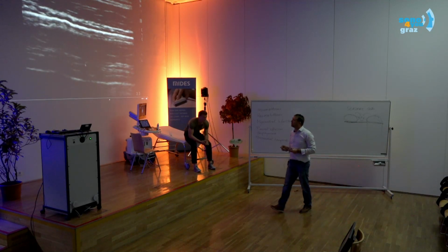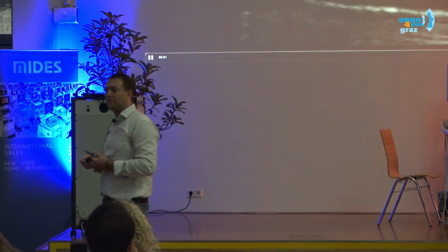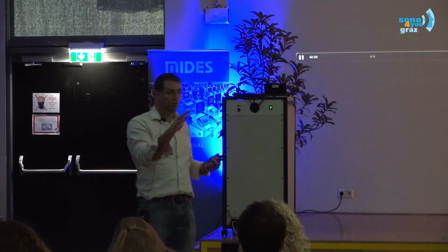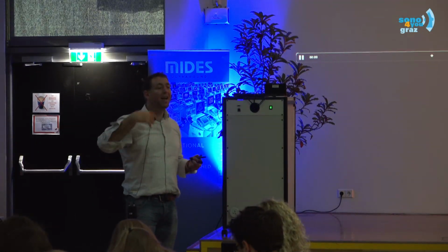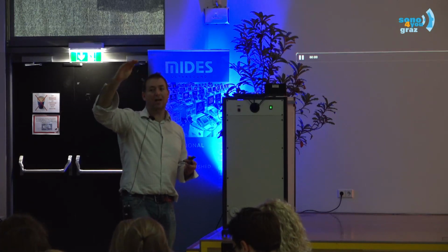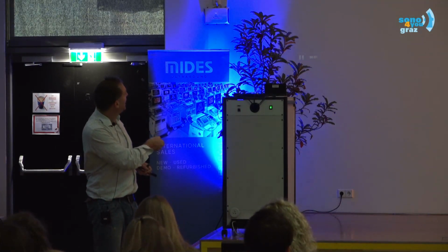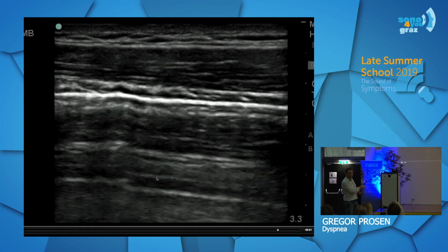Okay, back to pneumothorax. Does this patient most probably have pneumothorax? Sonographically, yes. He would have an intercostal space with pleura without movement. And on top of that, because this is pure air in the thorax, this patient also has reverberation artifacts. So I would say this one here is one A line. You agree with that? Yeah?